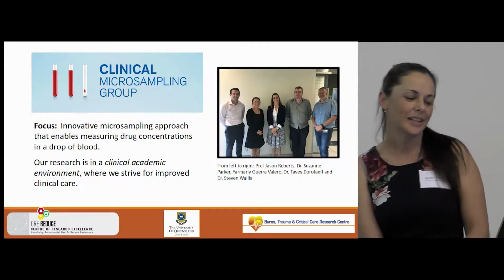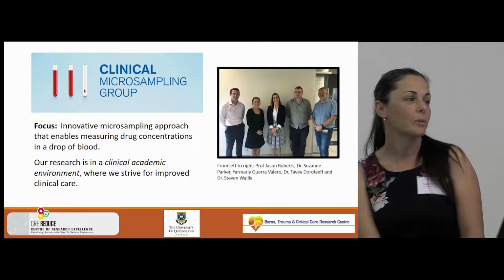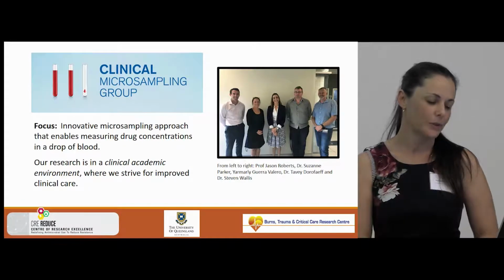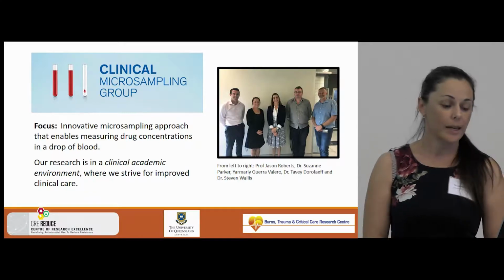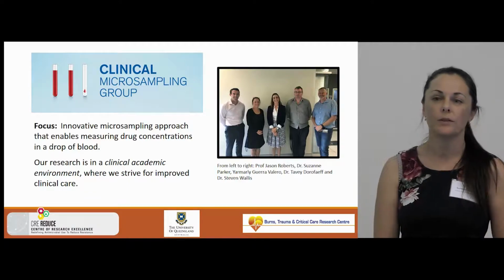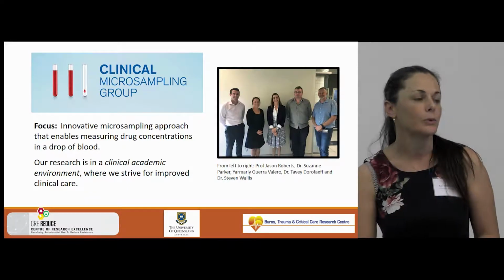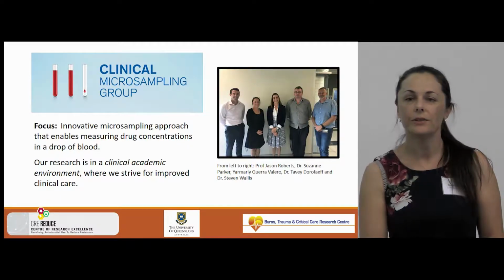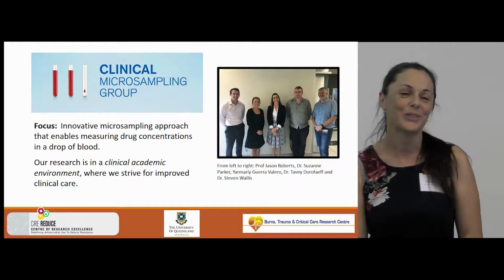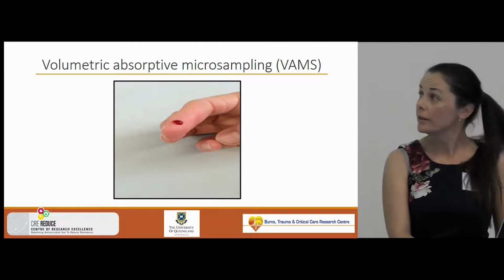As Sam mentioned, I lead our clinical microsampling group. Our group is based and supported by the Burns Trauma Critical Care Research Centre and the CRE Reduce at the University of Queensland. The aim of our research is to reduce the volume of clinical sampling, that is, to reduce the burden of blood taking by removing just a very small specimen of sample and then using these to reliably measure drug concentrations.